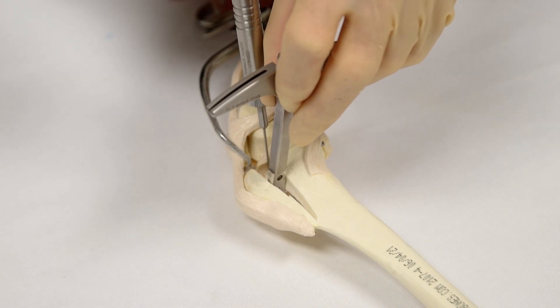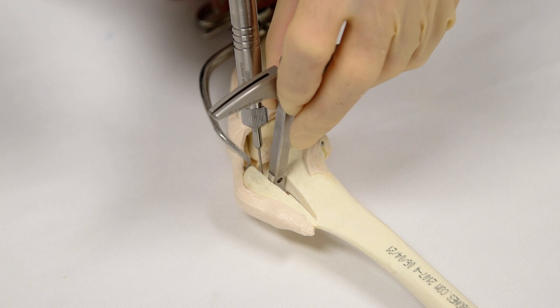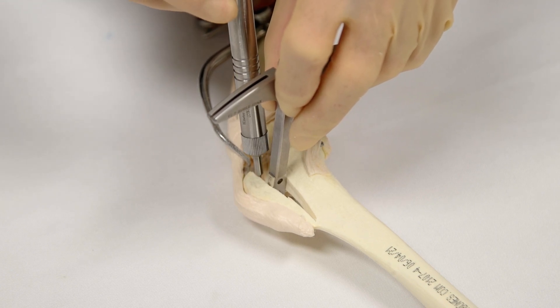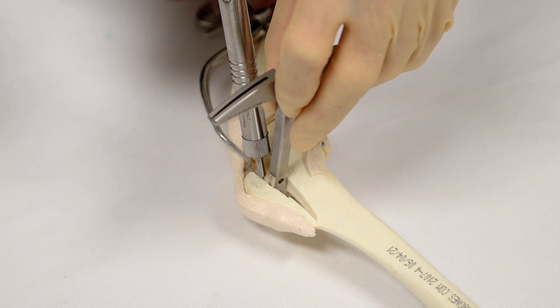The depth of the caudal cut surface of the tibia is measured near to the proximal aspect of the osteotomy. This measurement indicates the length of cage required. If between measurements, select the shorter cage.